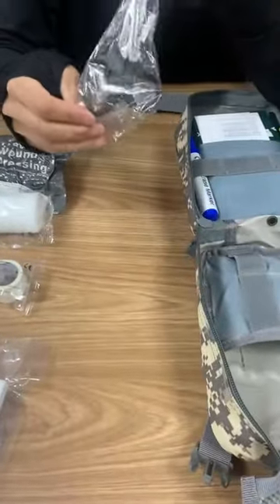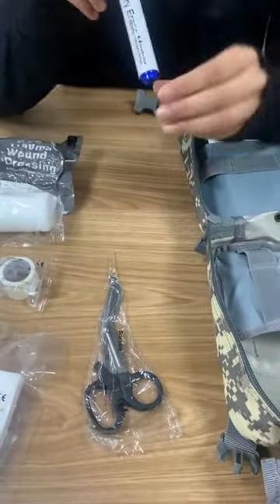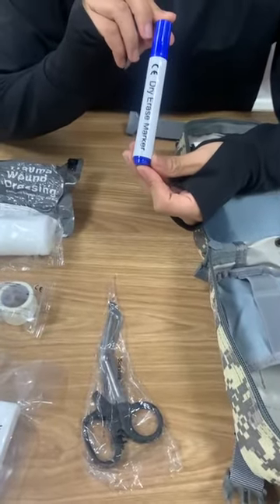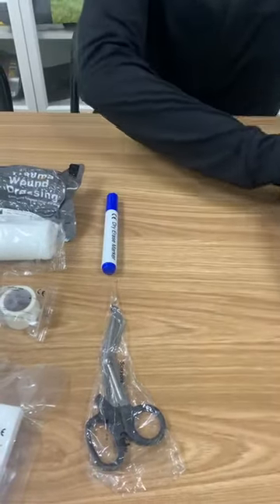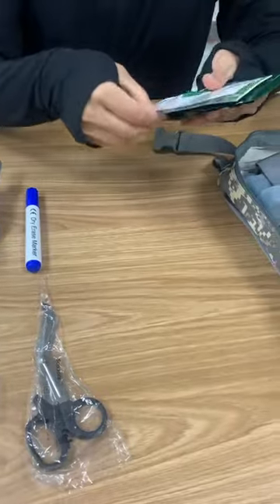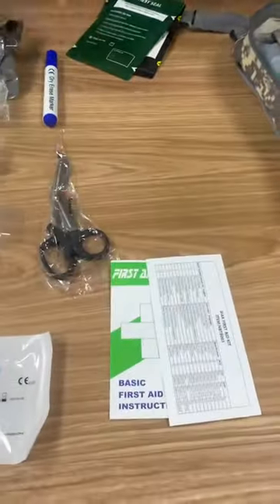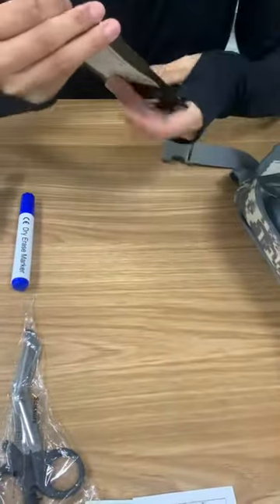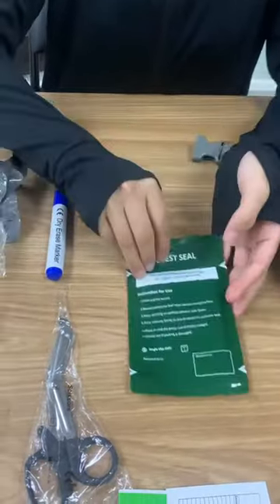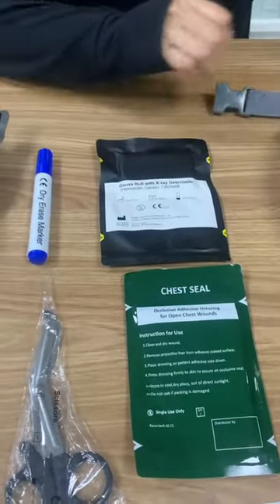And one scissors. And one blue color marking pen. And this is our instructions and tourniquet cap. And this is chest seals and one hemostatic gauze.